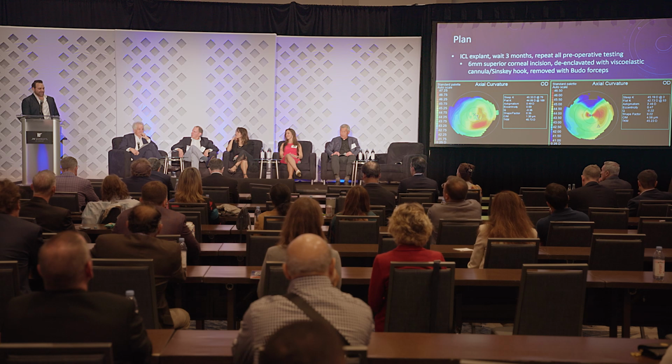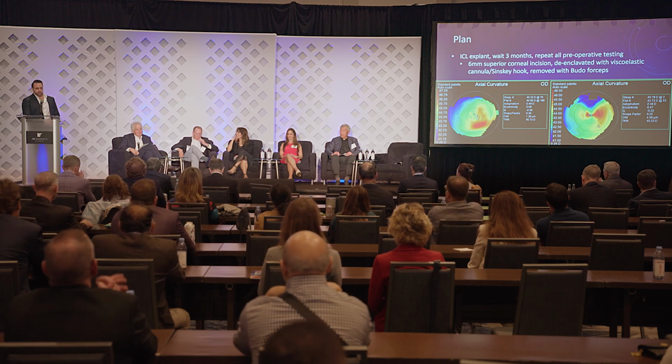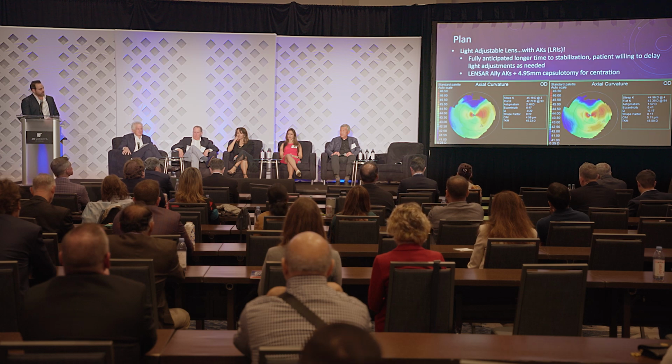Yeah, he didn't want that. He wanted the light adjustable lens. He wanted that accuracy. Now, I tend to make my main corneal incisions right at 180, 0-180, lined up nicely. So what we did here was we used the LENSAR ALLY laser, did a 40-degree arcuate AK at about 4 degrees, lined up nicely with my main incision. You can see that debulked the astigmatism quite a bit.